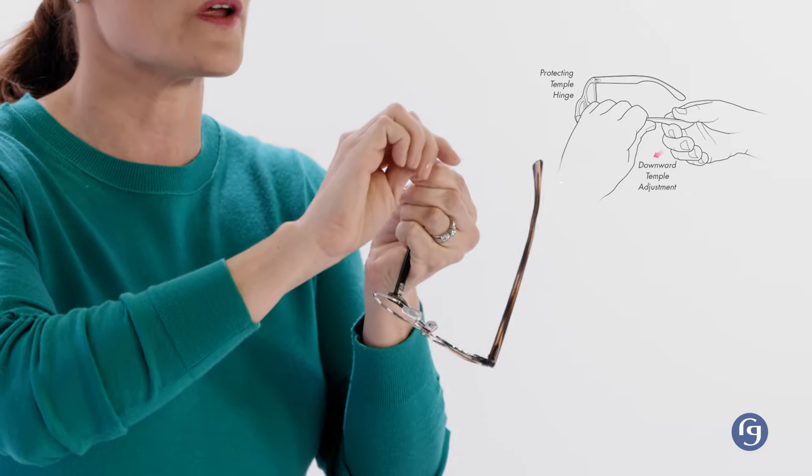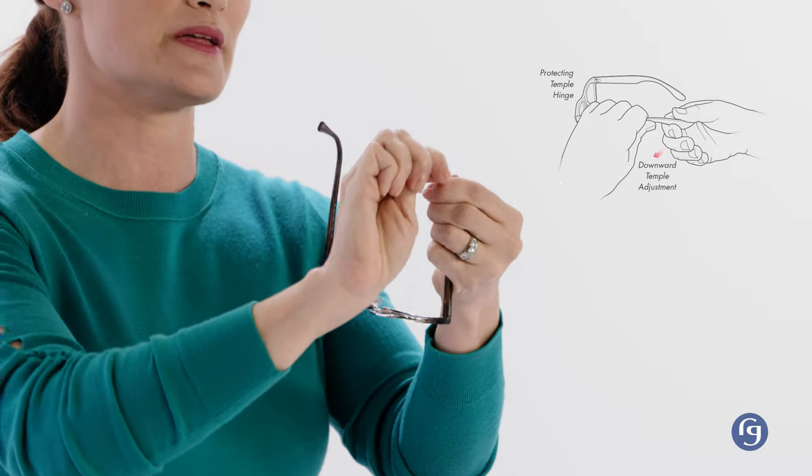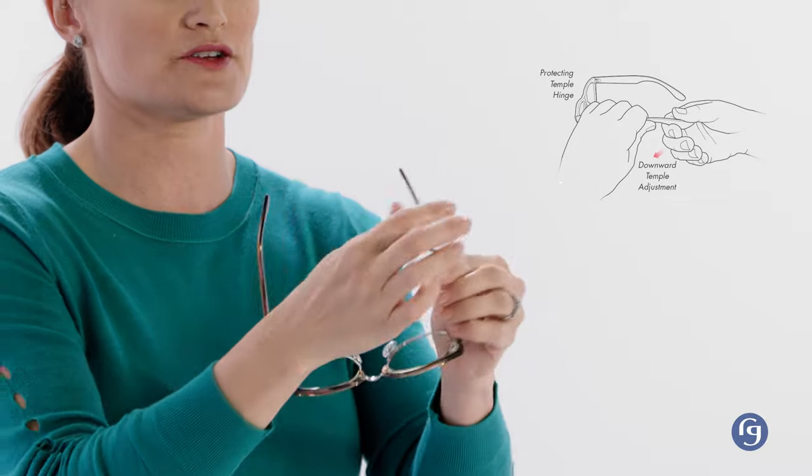Next I'll show you what to do about glasses that slide down your nose so that you don't constantly have to push them up. There's an easy fix for this as well. See how I can increase the bend of the temple arm where they curve over the ear for a more secure fit — you just bend them right down. Pretty good, no slippage.